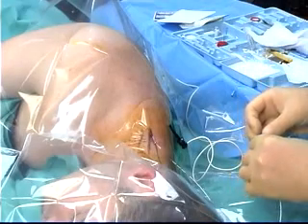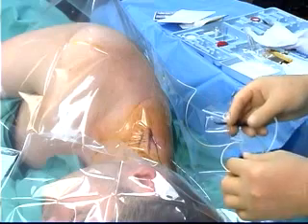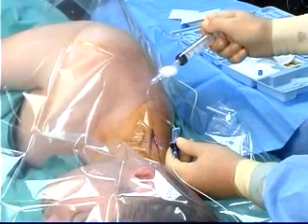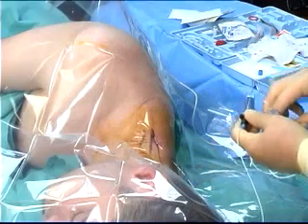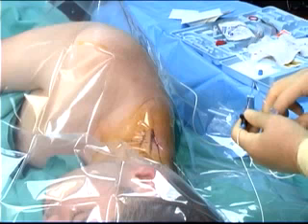Attach the snap lock to the catheter and attach the nerve stimulator to the snap lock. The motor response should still remain unchanged. Injection of local anesthetic agent or any other conductor of electricity that will decrease and disperse the current density at the catheter tip, such as saline, will cause the motor response to stop immediately. This is a positive Raj test and gives final confirmation that the block will be successful.